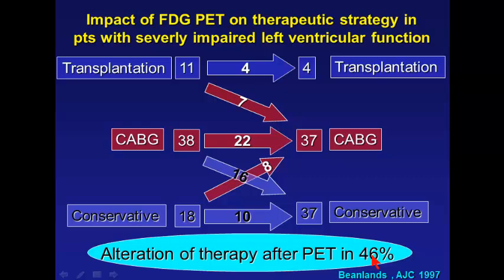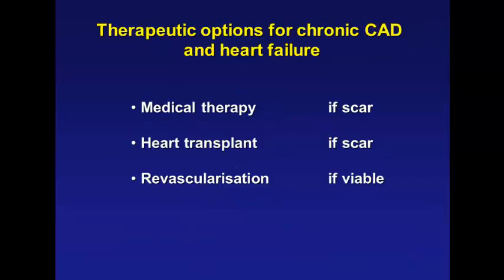Now this, however, just means that if you do an FDG PET, you change the treatment strategy. It doesn't mean that you do anything good to your patients. It just means you do a scan, you change the treatment strategy. It took a while to prove that this improves patients' outcome, and I would like to take you through the data of that.